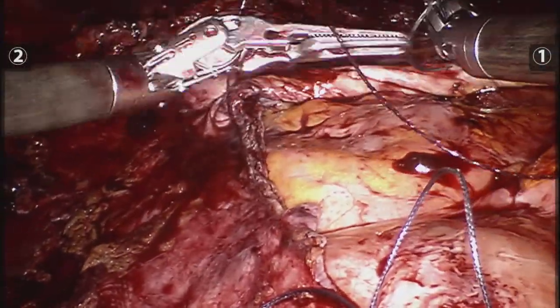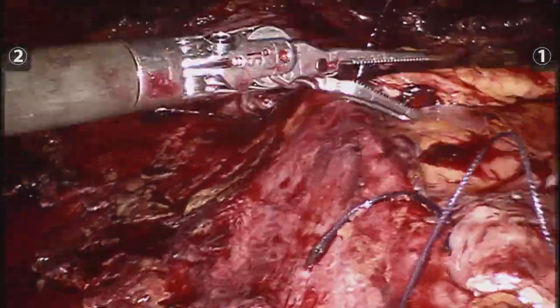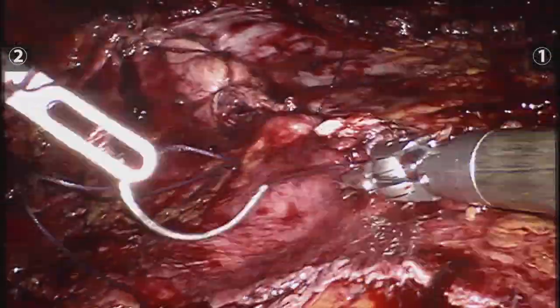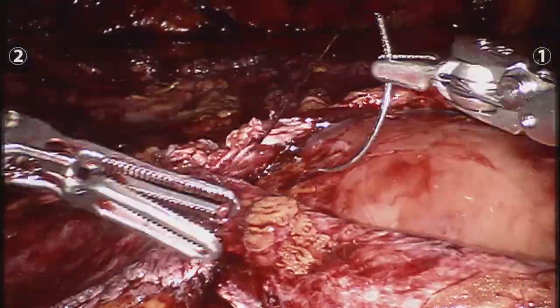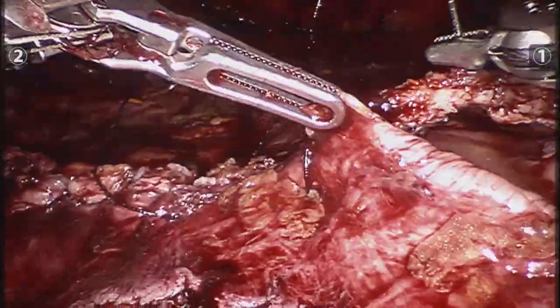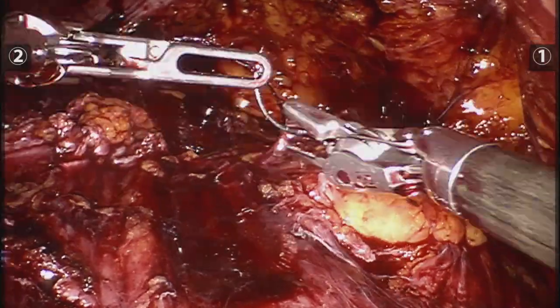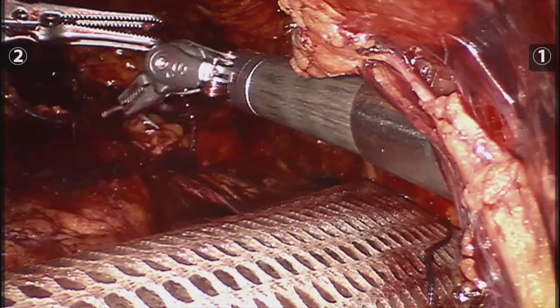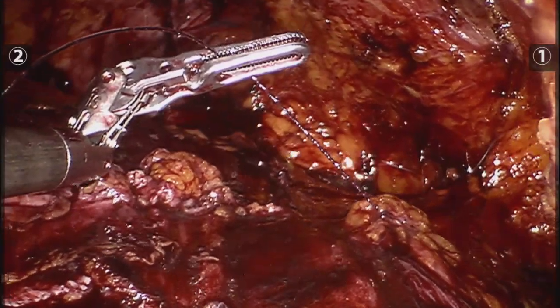The mesh I used for this first case was a Medtronic Symbotex 35 by 25 centimeters. I did not feel comfortable using an uncoated mesh because of the amount of peritoneal incidentals I had, and I didn't want to risk the bowel being exposed to an uncoated mesh and having my results compromised. Once I gain more confidence and decrease the peritoneal incidentals I will feel comfortable using an uncoated mesh.